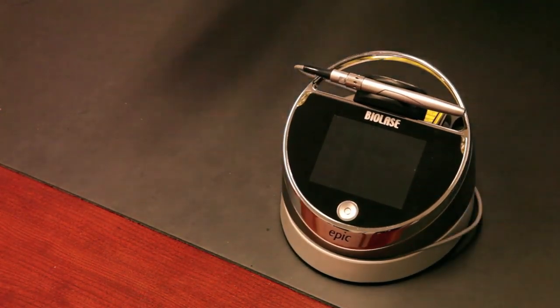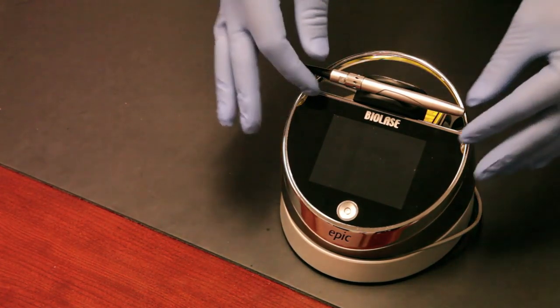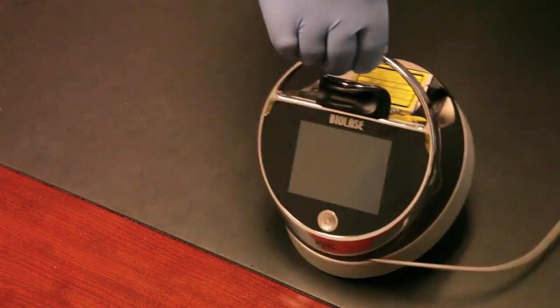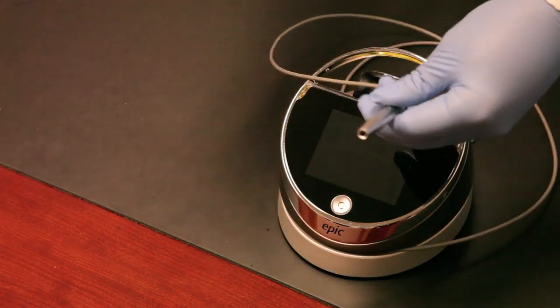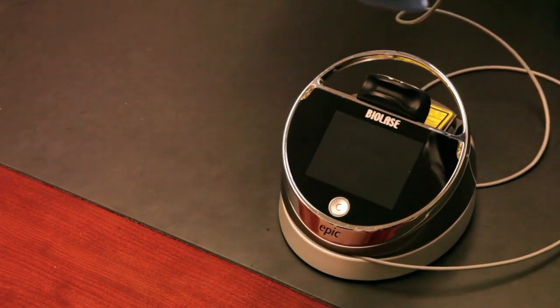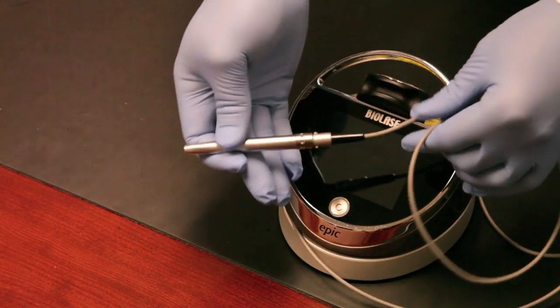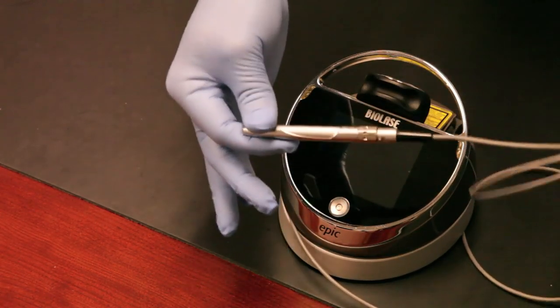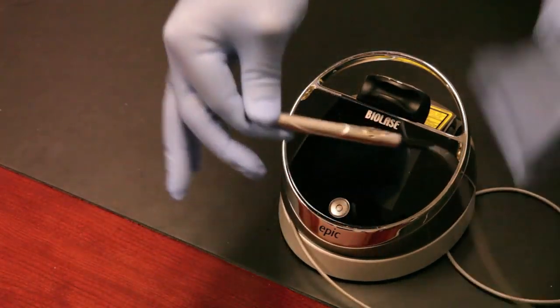Let's talk about the setup. Here's the EPIC laser with the surgical handpiece installed on the fiber. You can see the fiber unwinds around the base of the laser — real easy to manage. Before use, you'll unwind it. The fiber is real flexible — you don't want to bend it at a sharp right angle, never step on it, and never drop the handpiece. But you can see the fiber is real easy to use and doesn't get messy.